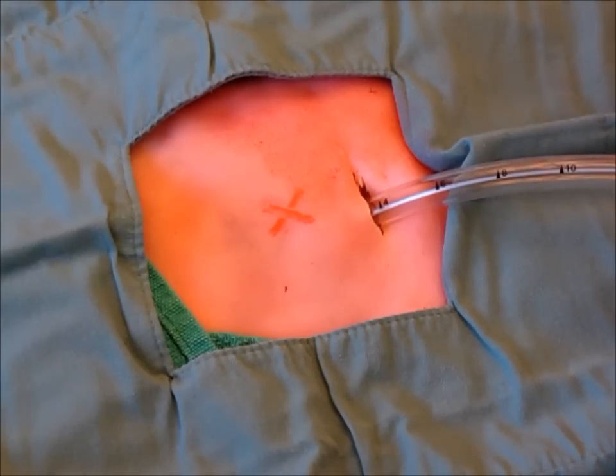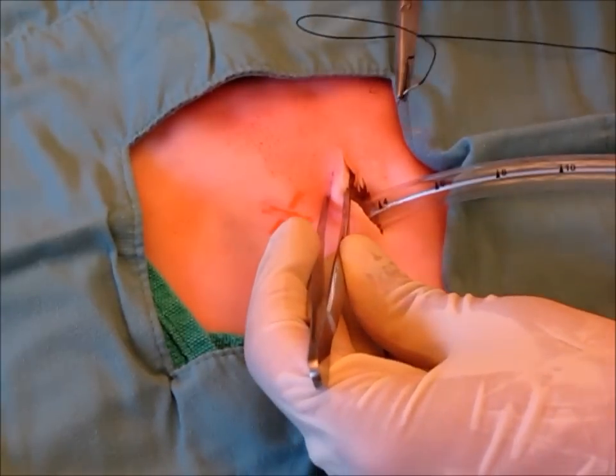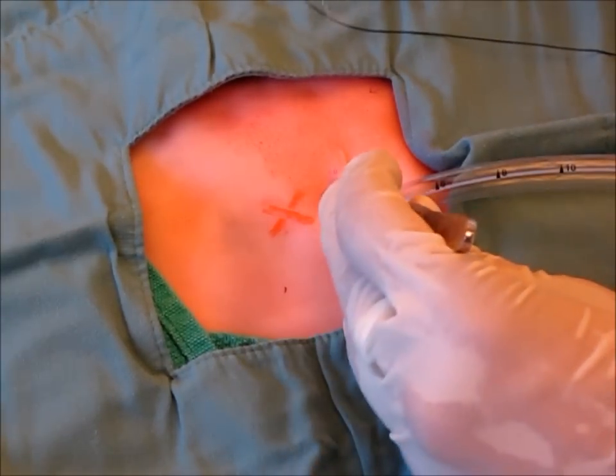Once the chest tube is in its desired location and depth, a suture must be used to secure the chest tube to the chest wall. Using O-Silk, the suture may be placed across the incision to ensure adequate seal.